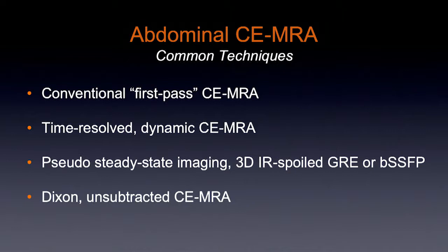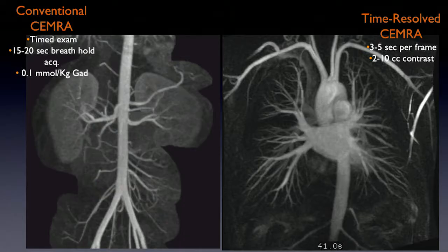And as one of the speakers earlier showed, there are strategies of bypassing the whole subtracted MRA approach and using a Dixon method without subtraction. So lots of options available. You can have one or two acquisitions with and without contrast and move on, or spend a lot of time adding things on to your exams. Just a couple of examples here.